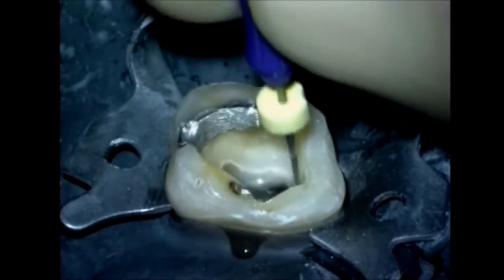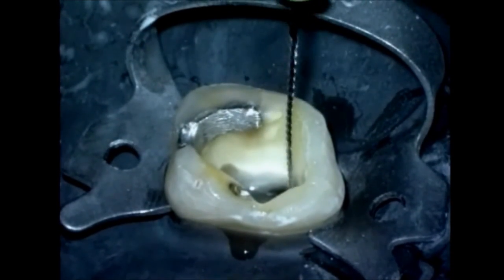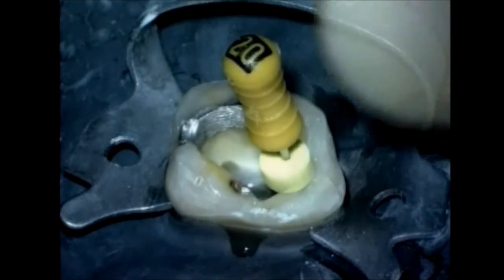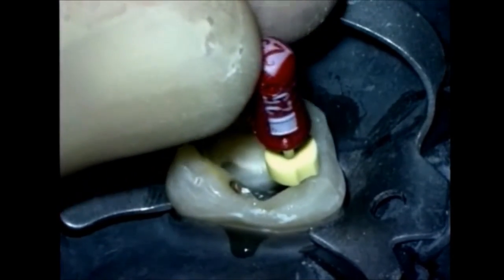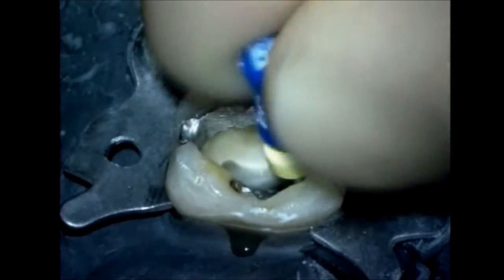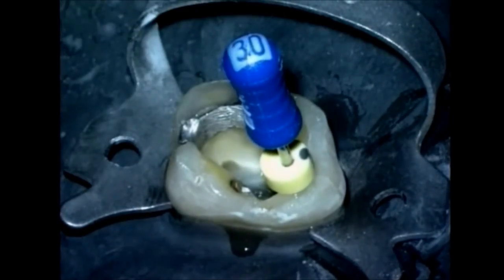Following the use of Finisher 1, which was a 20 at D0 and has a 7% taper, it's time to gauge. Gauging is accomplished by using an ISO .02 tapered 20 hand file. If the 20 hand file is snug at length, we're ready to pack. For first-time ProTaper users, it's important to appreciate the kind of shape that was just cut, and we can do this by using a series of ISO .02 tapered hand files. Tuning is the clinical exercise where each sequentially larger instrument is placed into the canal. When the handle is snug, the rubber stop is pushed down on the reference point.